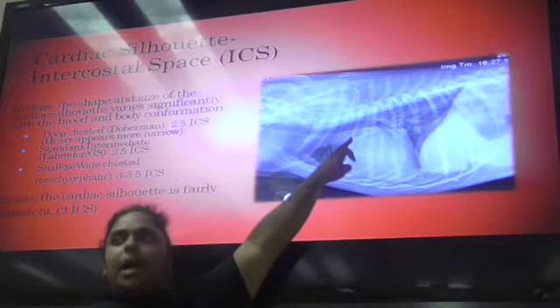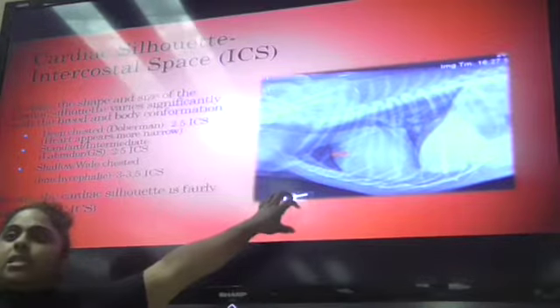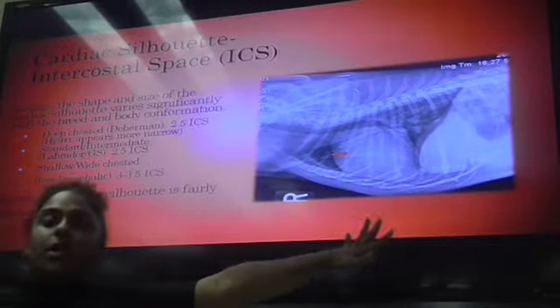And you guys will have time to practice this. This is probably going to be the best one for you to master because this is going to be the easiest one for you to look at and be able to multitask while you're talking to your technicians and trying to figure out what else you're going to do.